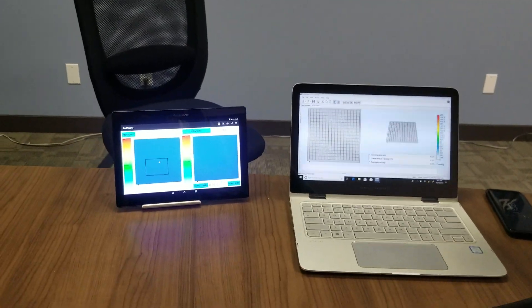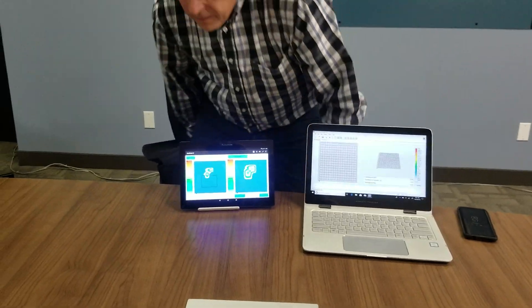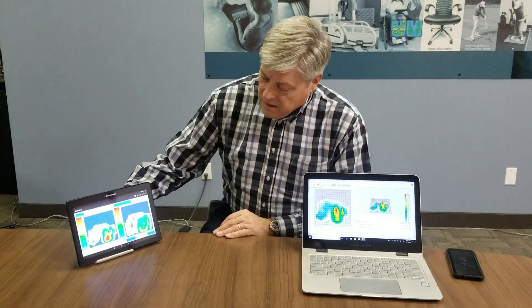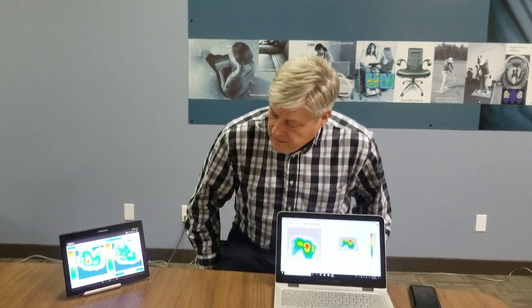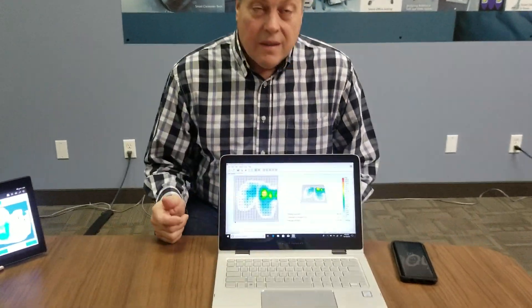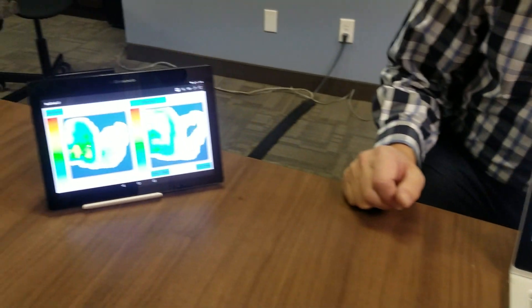So if I was to quickly sit on the sensor, you'll be able to see my posterior here. We'll rotate it here. Fairly firm surface, so we're getting nice bright red spots there. Whether it's in BodyTrack Pro, the clinical software, or it's in BodyTrack Lite, you'll see the same images.